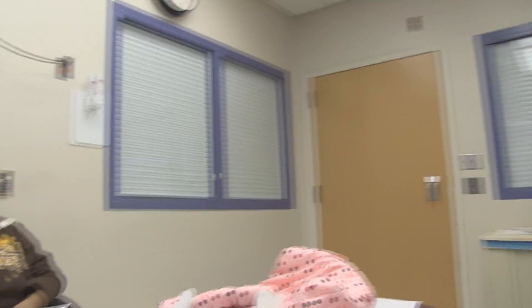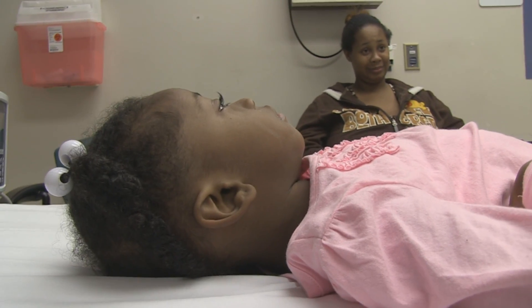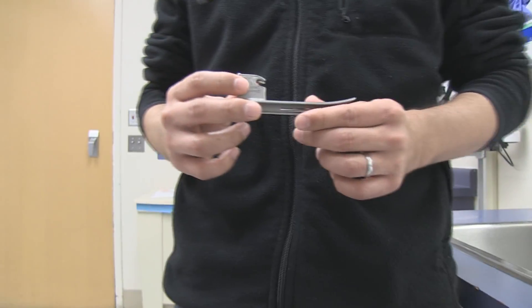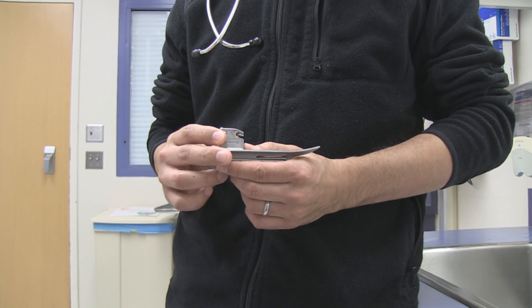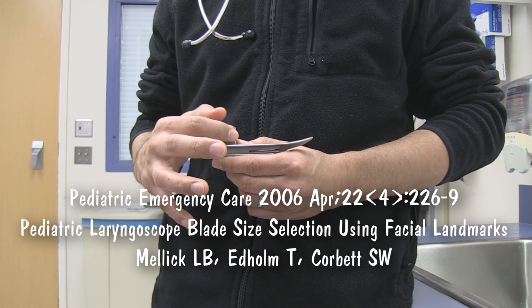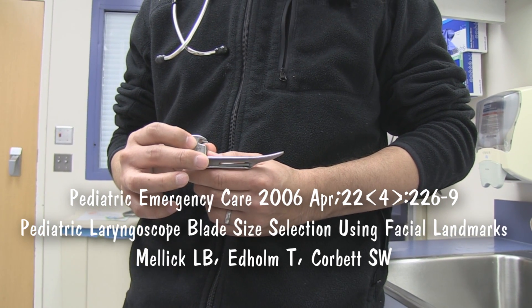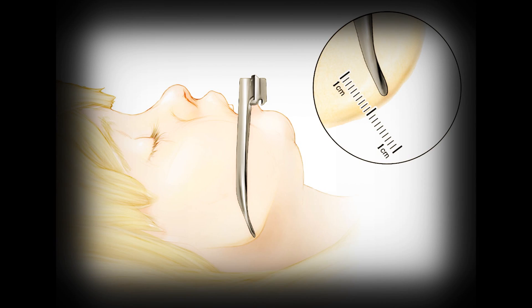What are the recommendations in the paper regarding blade length and anatomy? Using the Miller 1 straight laryngoscope blade as an example: the theory is that if you place the base of the blade at the central incisors — the upper central incisors — the tip, the distal portion of the blade, will be plus or minus one centimeter to the angle of the jaw. And that is the correct blade length.